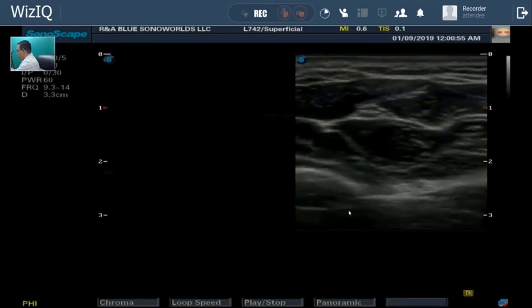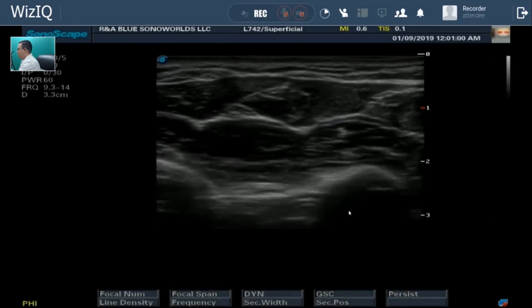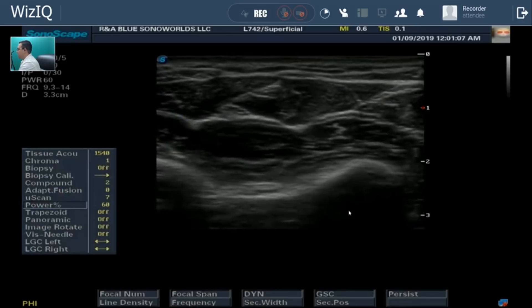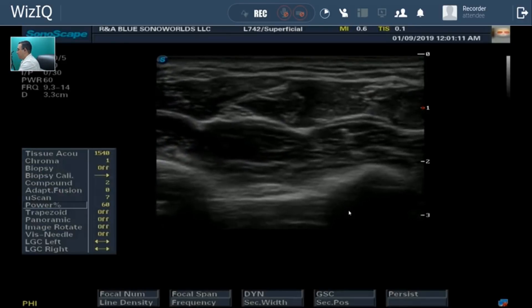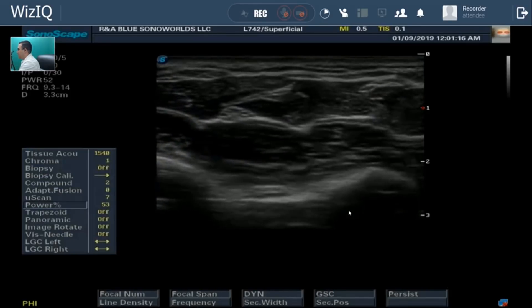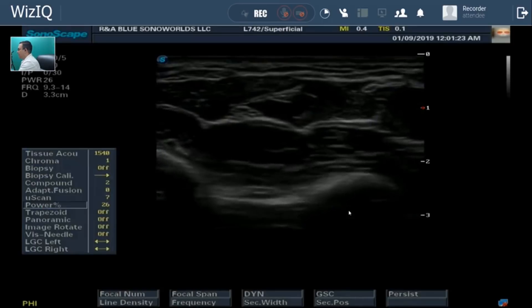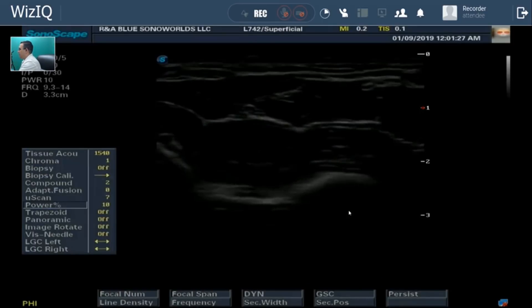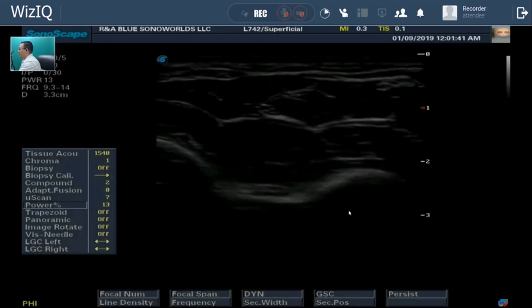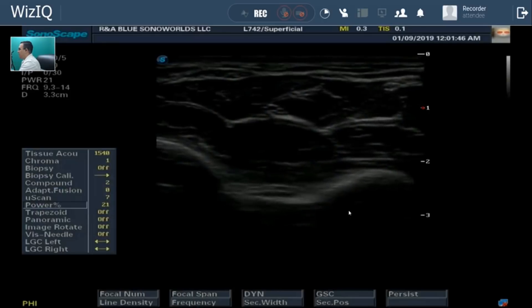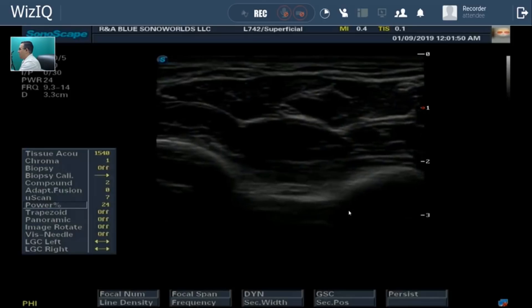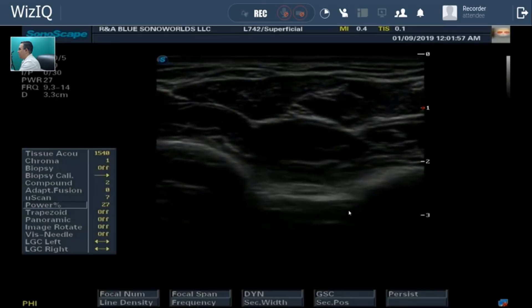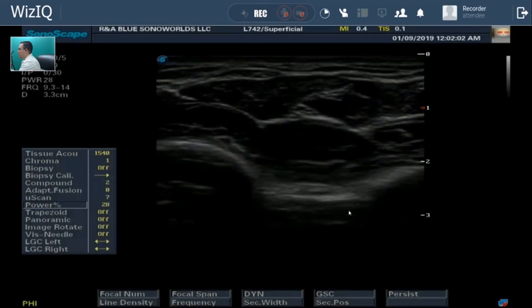So we're live now. I'm going to press here. And can you take a look to the left of my screen in there? Yes. This is power 60%. I'm going to reduce that power. Reduce the power. Reduce the power. More and more. Can you tell me what's going on? Well, the image is getting dark. The image is getting darker. Yes. It makes sense. And when I increase the power, then the image is just getting brighter. You know, the overall gain makes the same thing, right? The overall gain makes the same thing. It's just that the power makes it in transmission. And the overall gain makes the same in reception. The power is the function of the pulser and the overall gain is the function of the receiver.